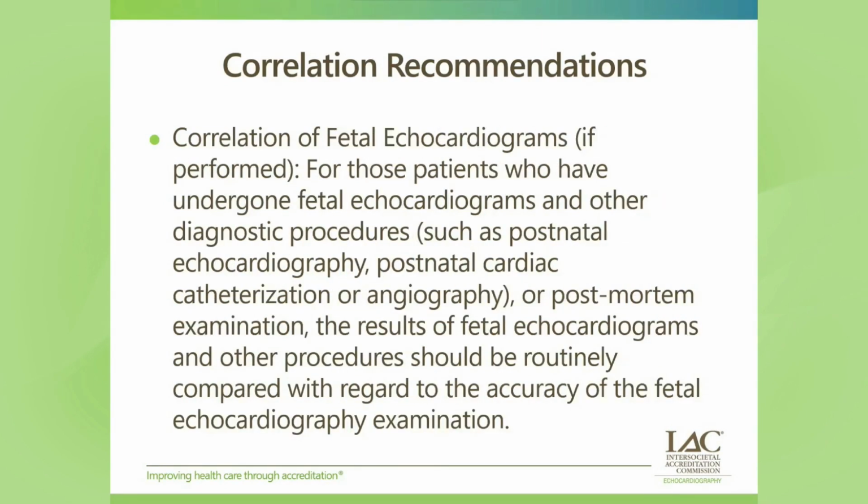And then when you're doing fetal echo, for patients who've undergone a fetal echo and then some other diagnostic procedure, most likely your postnatal echo, a cath, or an angiogram, postmortem if necessary, these results of our fetal echoes and other procedures should definitely be compared with regard to the accuracy of the fetal echo. So this gives you a really great learning opportunity.